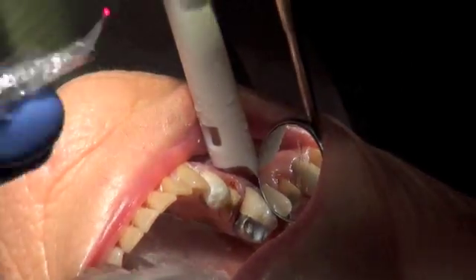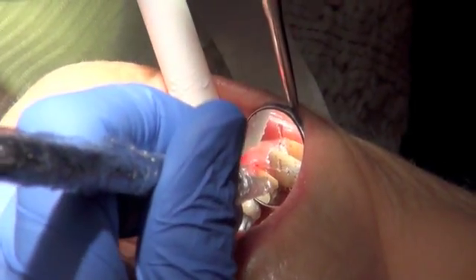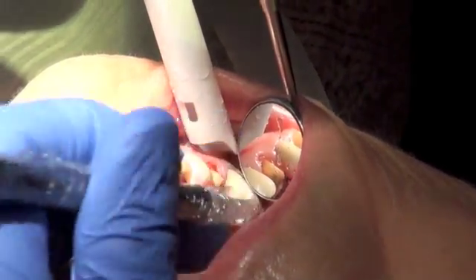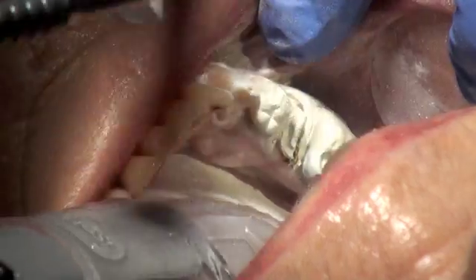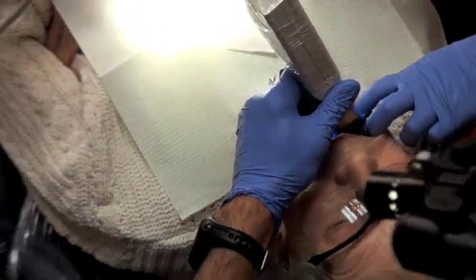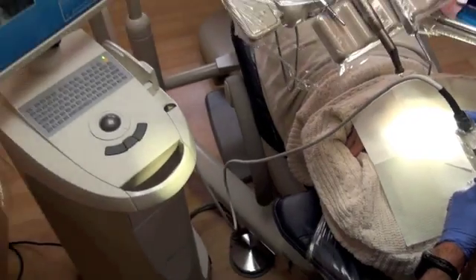The laser is then used to delineate the margins, or the edge, where the crown will meet the natural tooth structure. This ensures a perfect seal, which is accurate to five hundredths of a millimeter, or 50 microns. An opaque ink powder was then applied so that the camera scanner of the CEREC acquisition unit could take an infrared image of the situation.